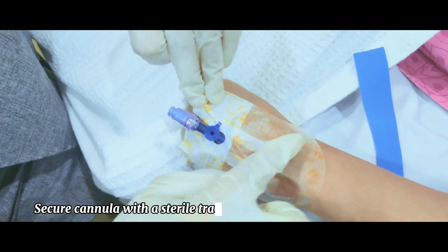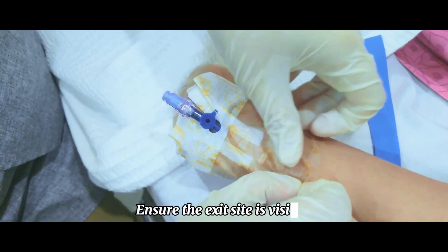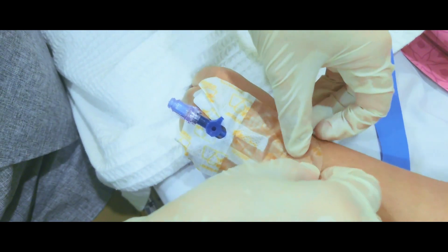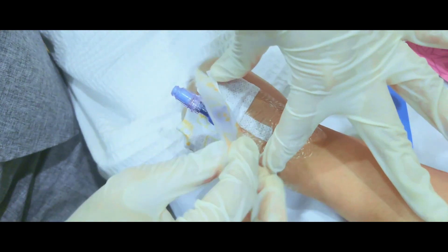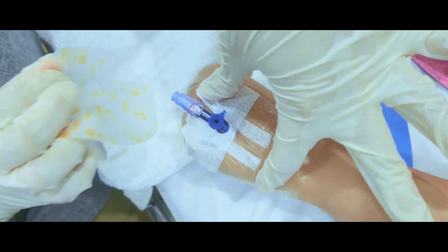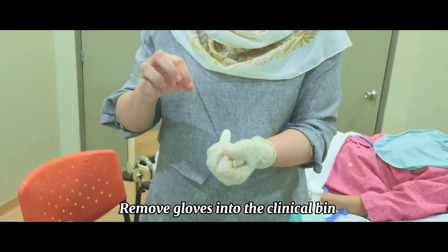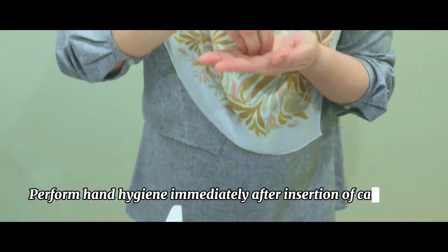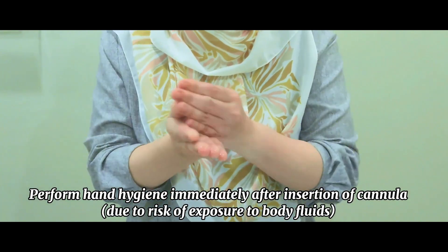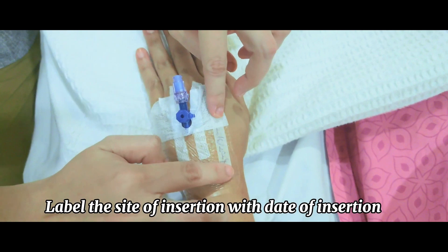Secure the cannula with a sterile transparent semi-permeable dressing, ensuring the exit site is visible. Remove gloves into the clinical bin. Perform hand hygiene immediately after insertion of the cannula due to the risk of exposure to body fluids. Label the site of insertion with the date of insertion.